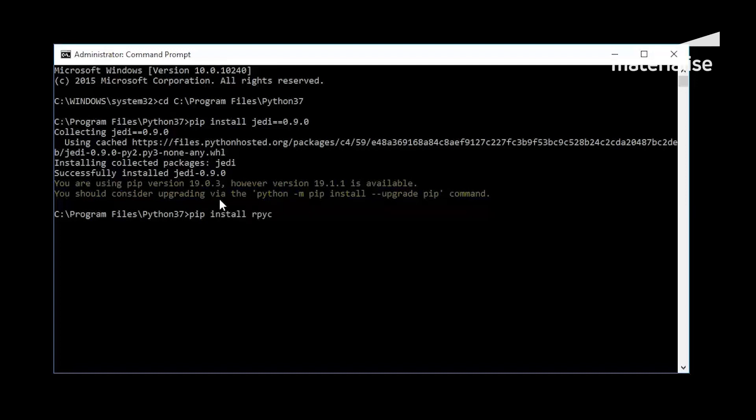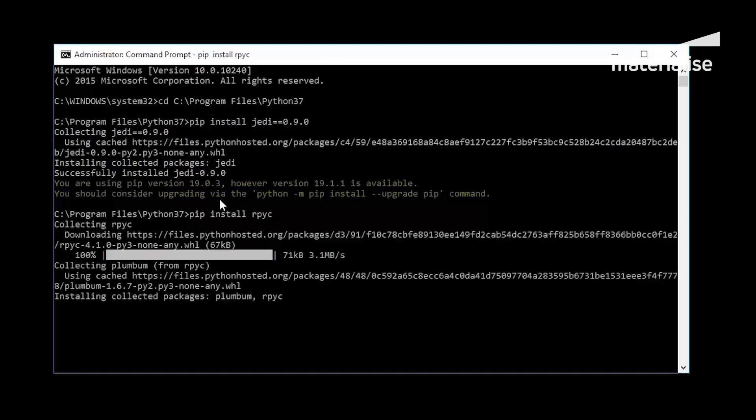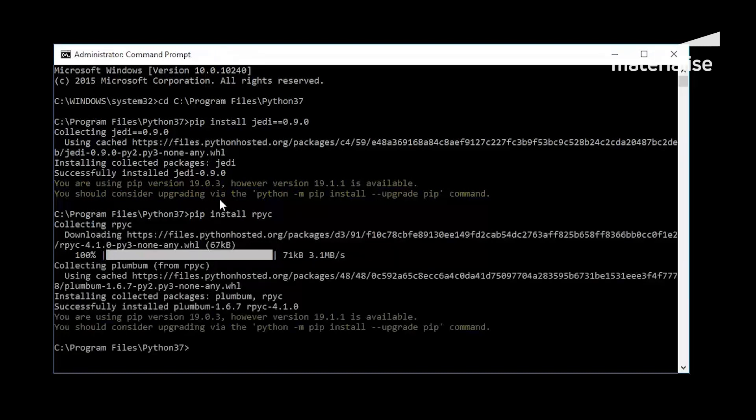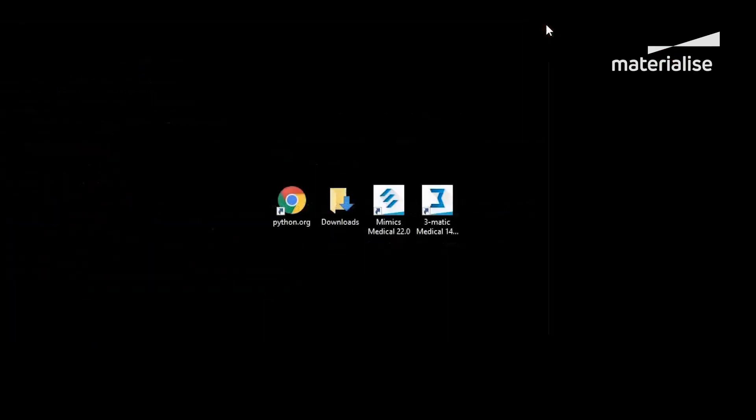The RPYC package allows users to activate the toggle listener functionality, which allows interaction between 3-matic and external editors like PyCharm or Visual Studios. For further information, please refer to the installation guide in the Materialize 3-matic scripting guide.